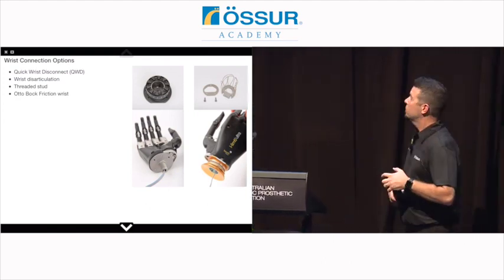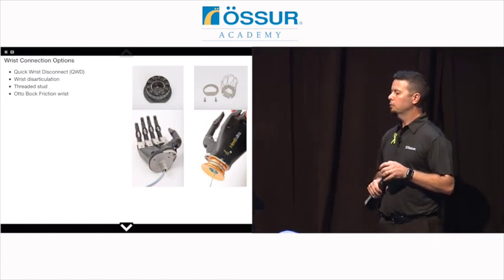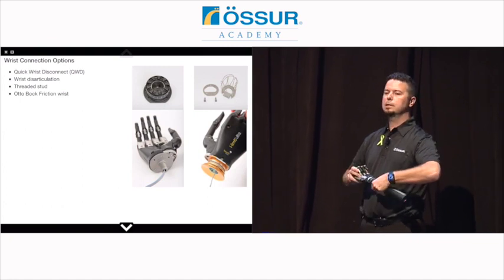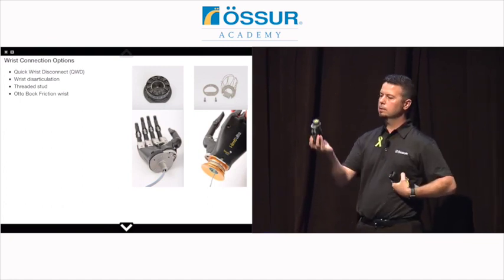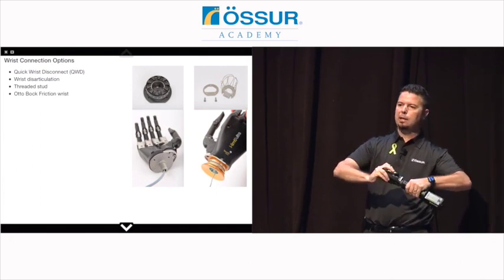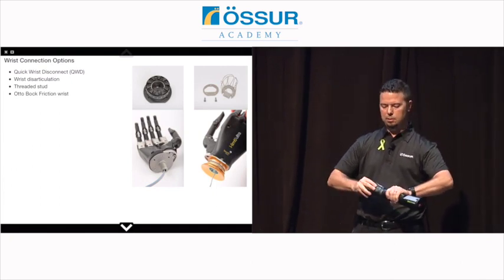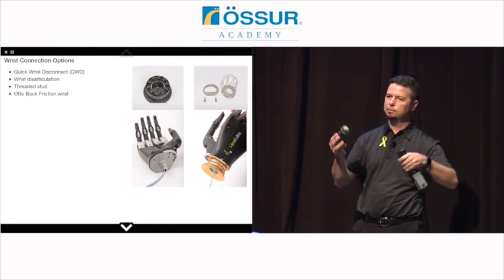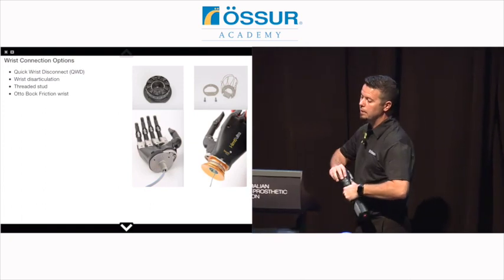All right, let's talk about componentry. When you order the hand, you can order it with 4 different attachment points. The standard is going to be a QWD, or a quick wrist disconnect. That's that industry ball bearing standard connection that allows you to manually pronate and supinate the hand and remove it to insert another terminal device in the same prosthesis. That's the default. However, sometimes you don't have that much room.